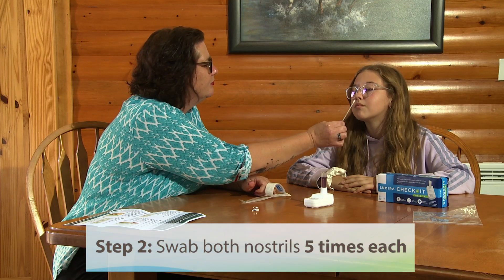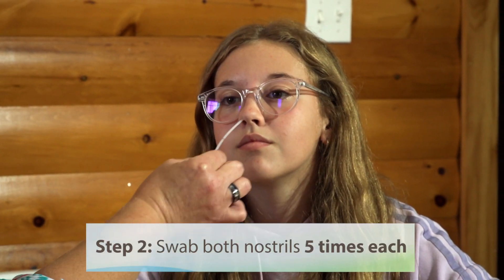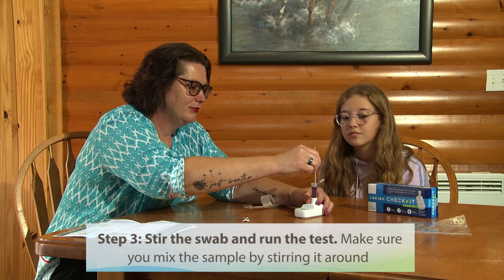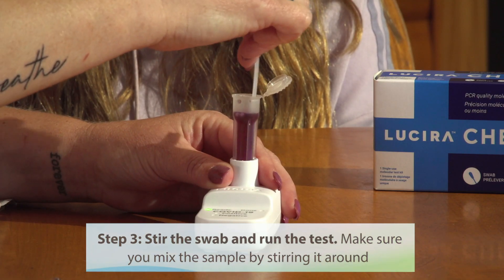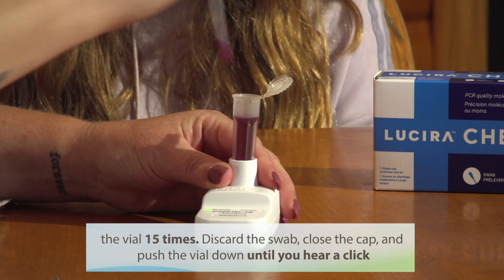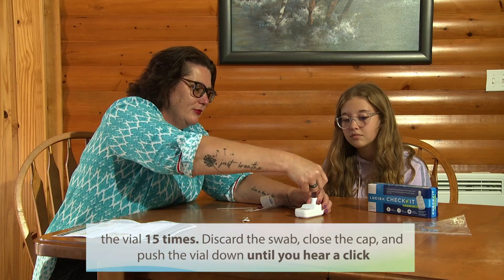Step 2: Swab both nostrils five times each. Step 3: Stir the swab and run the test. Make sure you mix the sample by stirring it around the vial 15 times. Discard the swab, close the cap, and push the vial down until you hear a click.